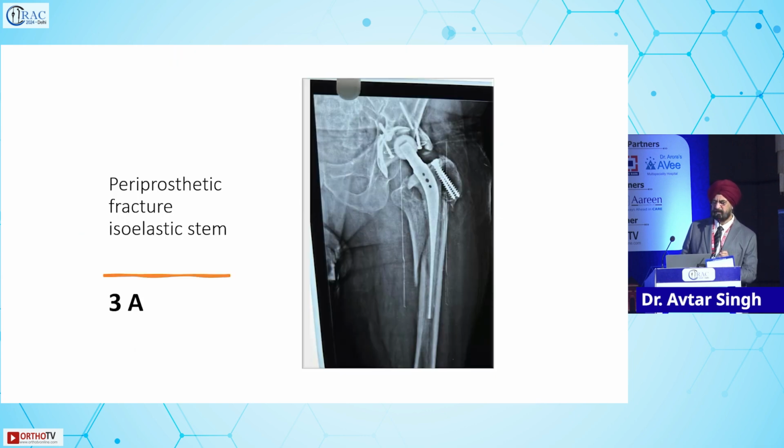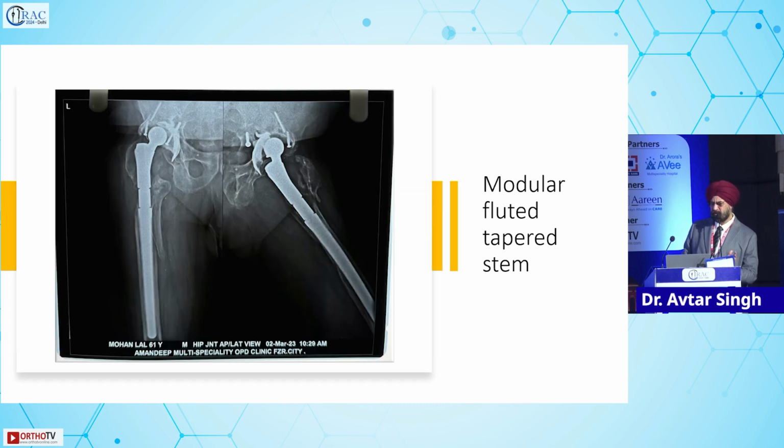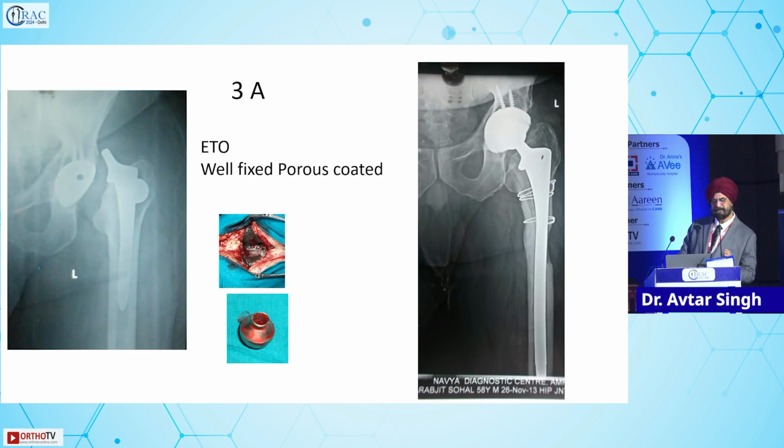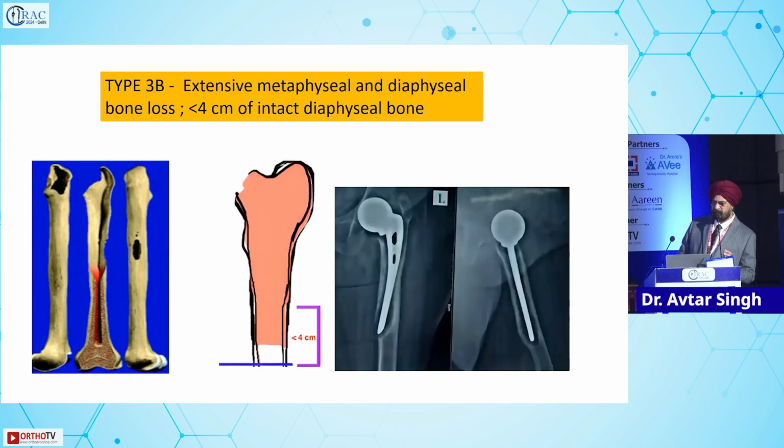Periprosthetic fractures, although Paprosky doesn't cover it, it's covered under AOS. Long stem, whether modular or non-modular, will work. Similar situation, a non-modular Wagner stem. And then many of these trunnions fail. This was a particular kind of trunnion with some company, a number of revisions.